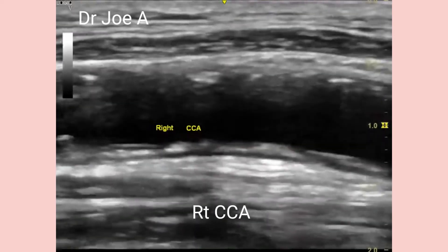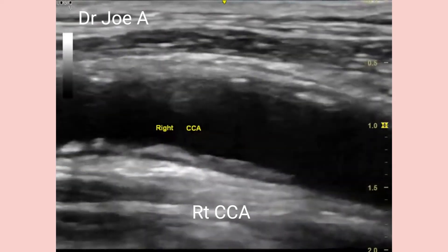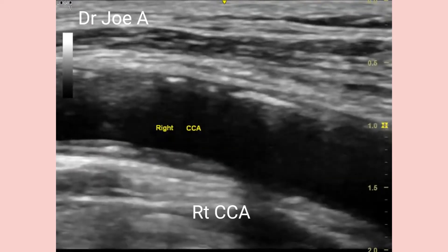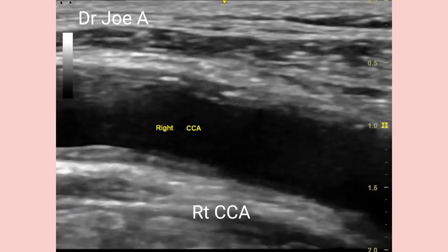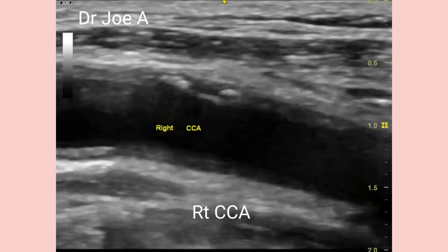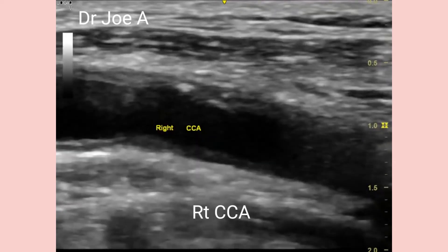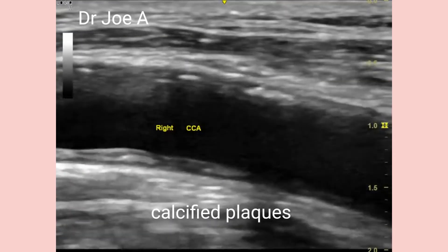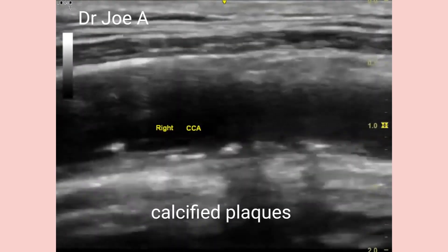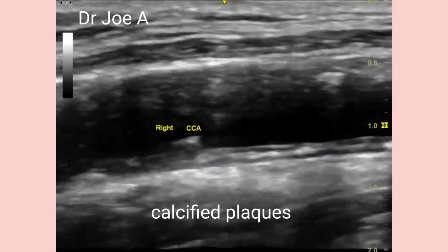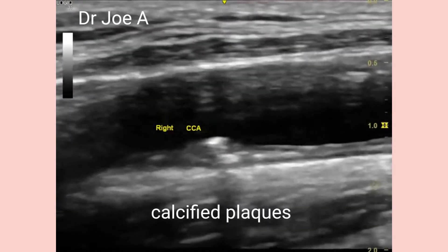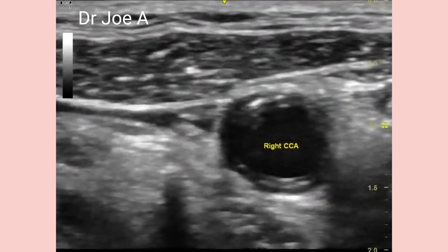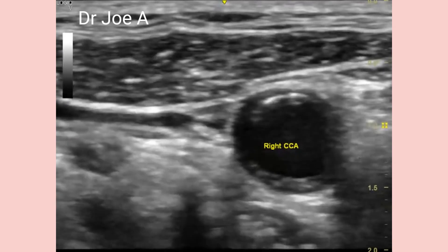Severe calcific atherosclerotic changes are also seen in the right common carotid artery. The right common carotid artery also shows significant increase in intima medial thickness. These changes can also be seen in the axial section of the right common carotid artery.